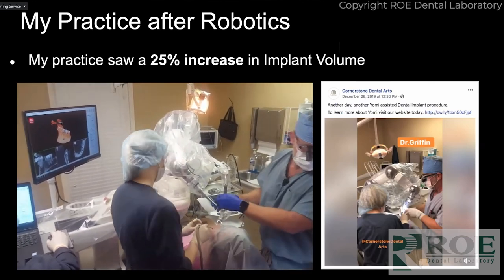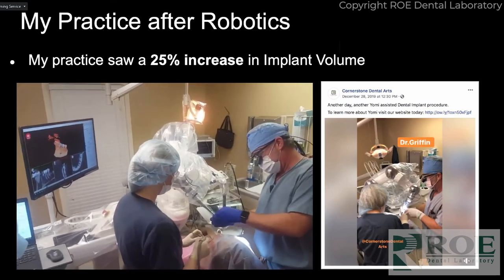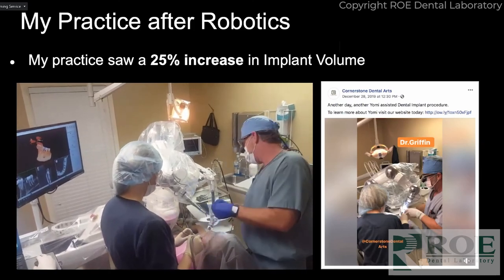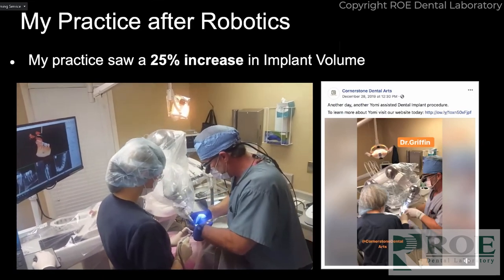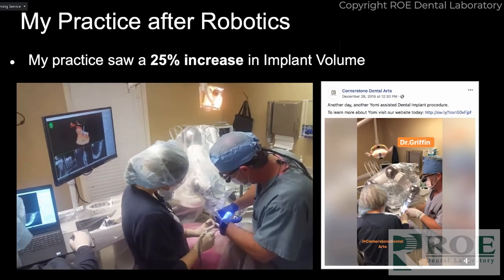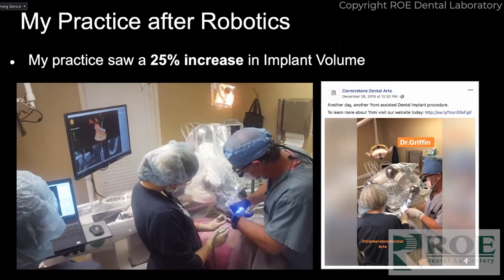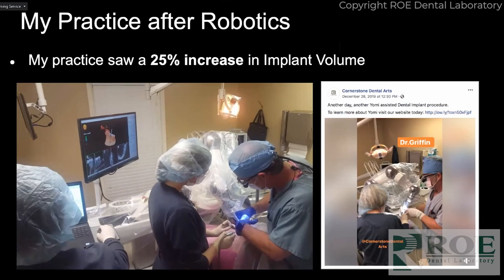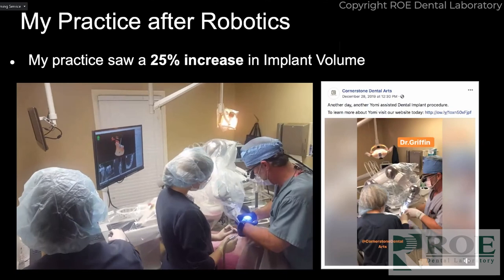The patient's not sedated. It's really calm in the room — and I'm not a calm guy; I tend to be a little cowboyish and loud. But there's so much confidence in the technology. You're getting guidance, you're watching the screen, you can look in the mouth, you've got the audio cues. It really is full technology and everyone is calm. I'm looking at the screen and looking in the mouth.